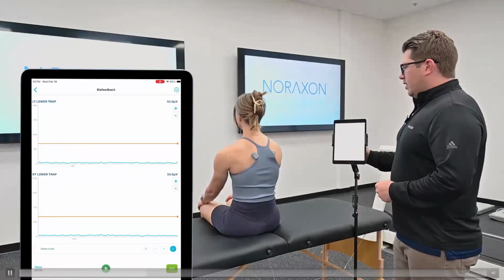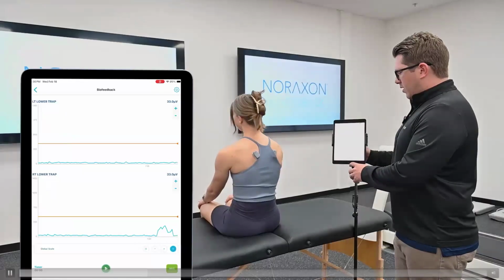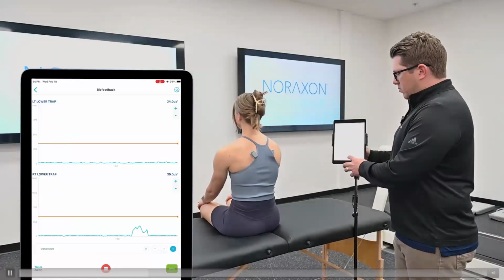So I'm going to count you in, and then you'll just go ahead and activate as much as you can, okay? All right. Ready? 3, 2, 1, go.